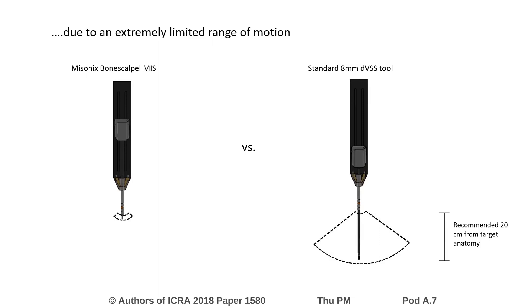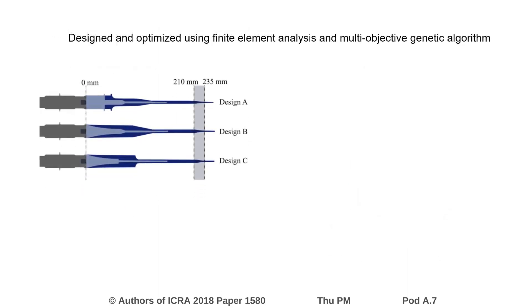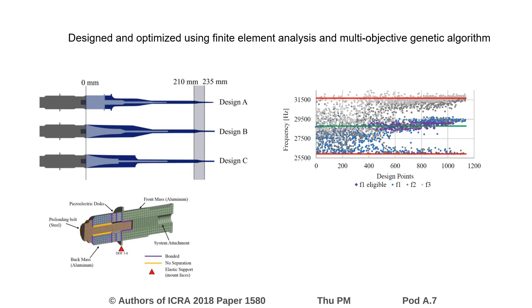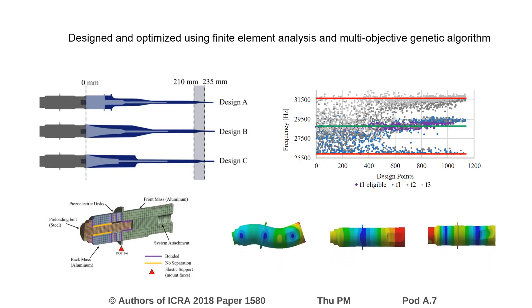Additionally, the development of a new da Vinci-specific bone cutting tool allows for additional customization. The system was designed using a finite element analysis approach. A multi-objective genetic algorithm available in ANSYS was used to optimize user-provided design spaces. The ultrasonic transducer was also modeled using electromechanical analysis.